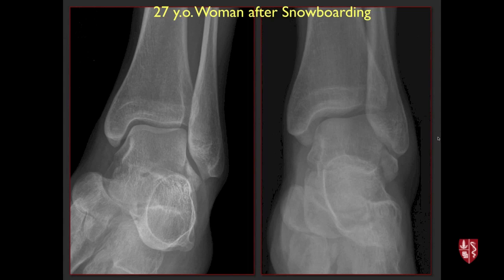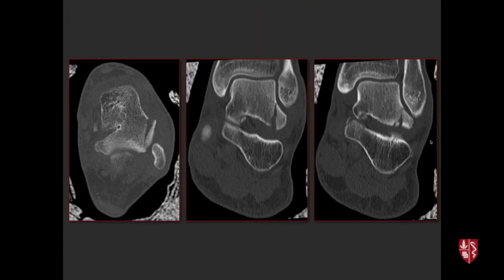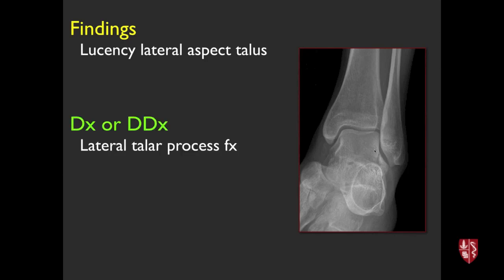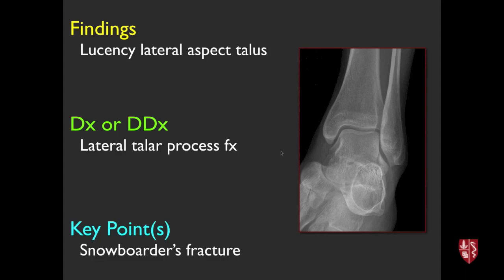Young woman with a snowboarding injury. Radiographs hint at a lucency; CT confirms a definite lucency involving the lateral talar process. This is a so-called snowboarder's fracture, an injury known to occur with snowboarding and similar sport activities. They can be easy to miss on plain film, so it's important to be aware of this injury pattern.